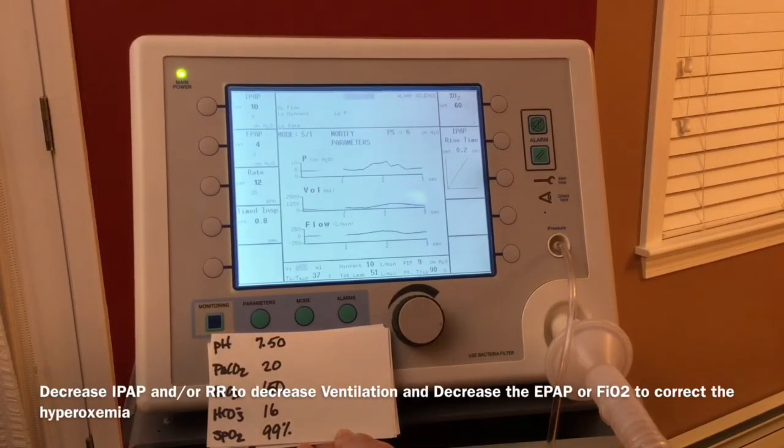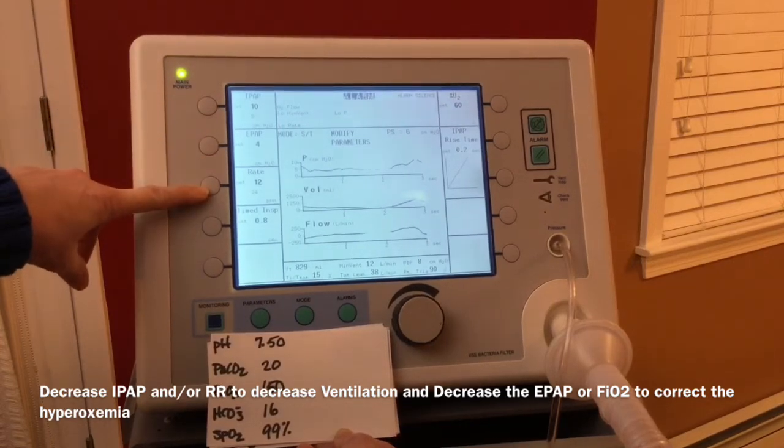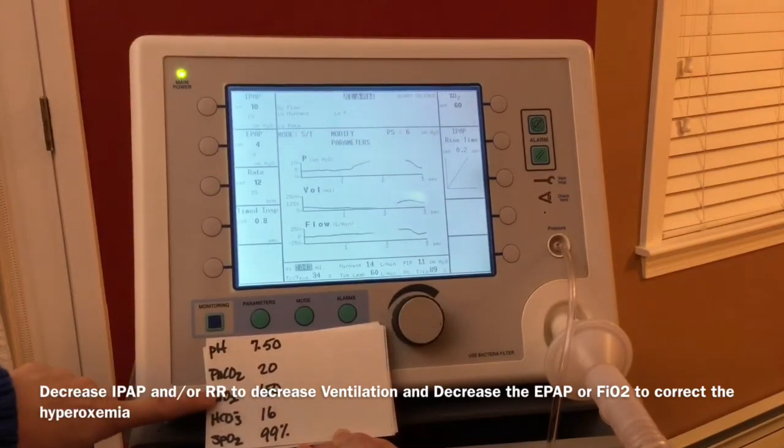If you said that you would decrease the IPAP or decrease the respiratory rate to help compensate for the respiratory alkalosis and raise the PaCO2, you were correct. If you said decrease the FiO2 to correct the hyperoxemia, you were correct.